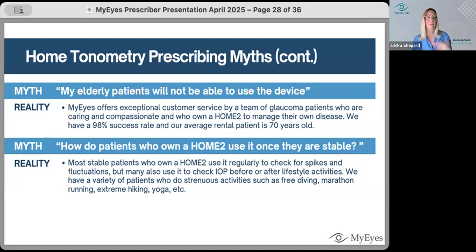So my vision was super blurry. First thing I check is my pressure. So I started to check my pressure for 2 or 3 days. It's fine. And with the Baerveldt, it's low. I'm under 10, which is just huge. So I checked it, it was fine. I thought, okay, it must be cornea related. So I start doing the drops and the ointment for the cornea swelling and things like that.